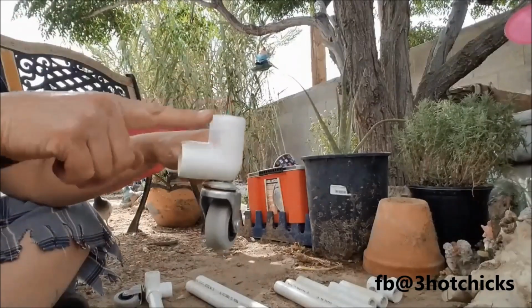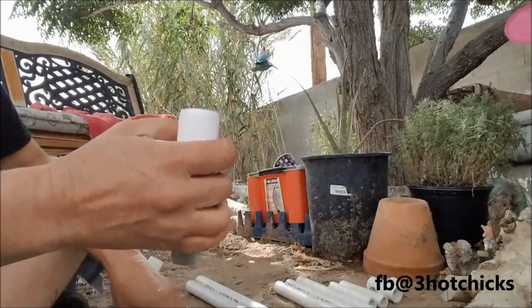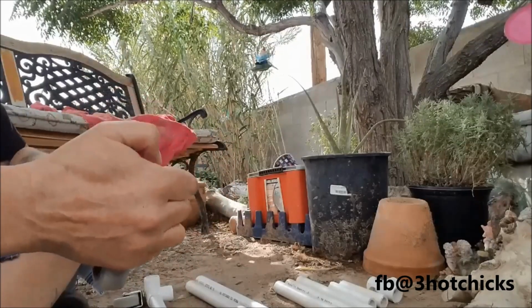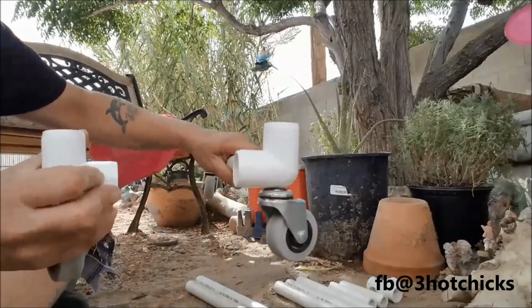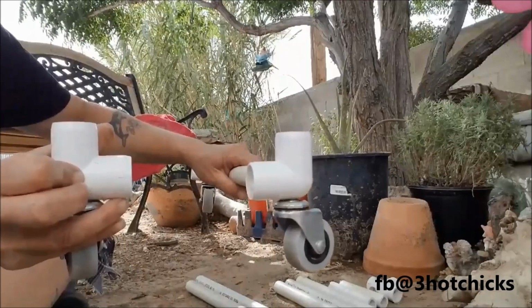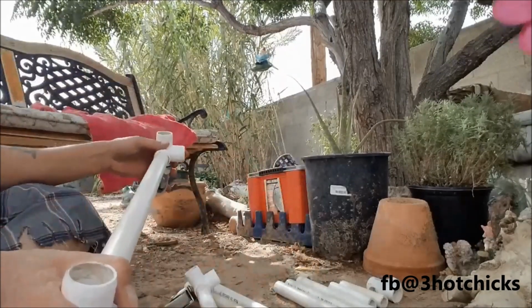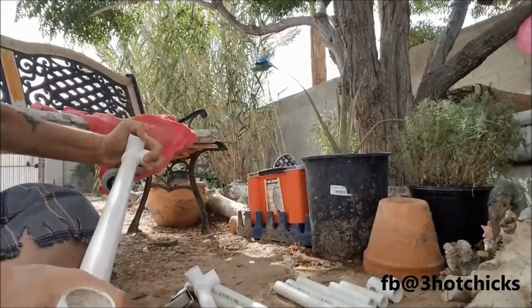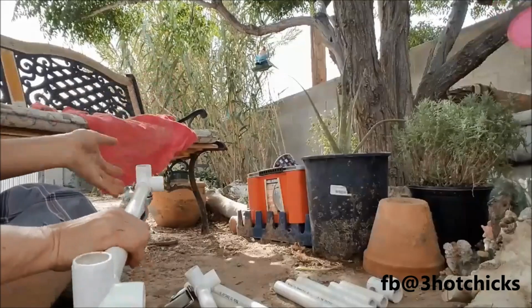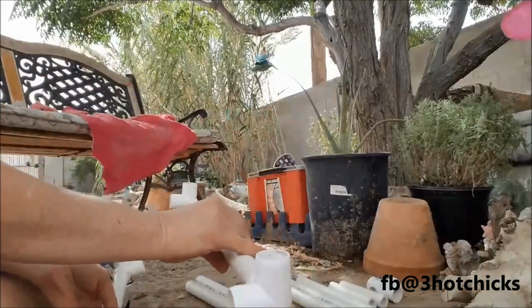One of the T fittings goes up, one of them goes towards the middle. I gotta switch this one, because I want it to go like this. So you want one going one way and one going the other. And then the other wheel is going to go on this side. And just pop it into the PVC. So now I got 2 lengths there, and I'm going to add my sides.